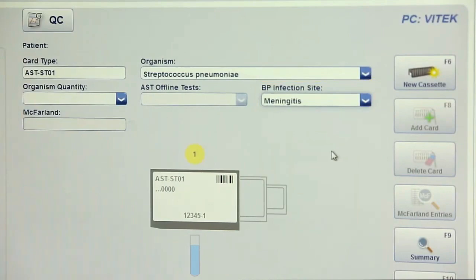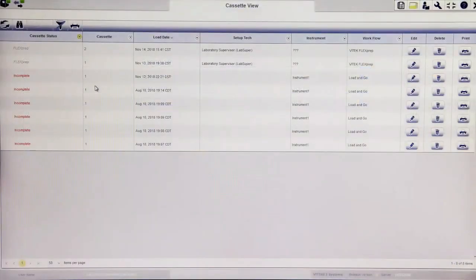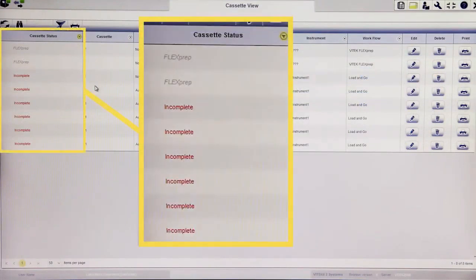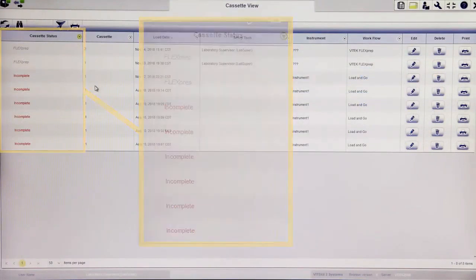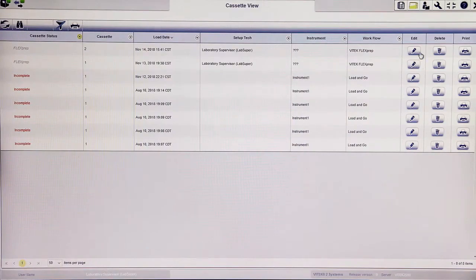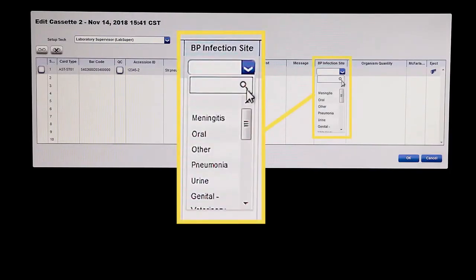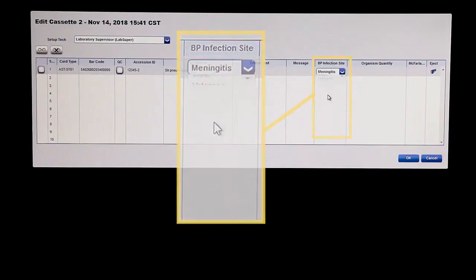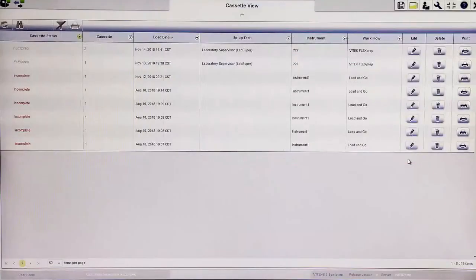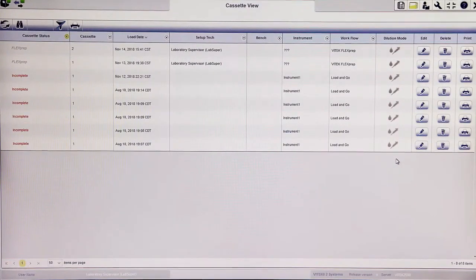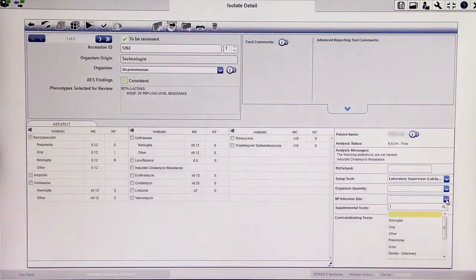If an infection site was not selected in Vitec FlexPrep, it may be entered in cassette view, as long as the cassette is not at a status of complete. To accomplish this, click edit and select the desired infection site from the BP infection site column. An infection site may also be selected from the isolate detail view of the worklist.